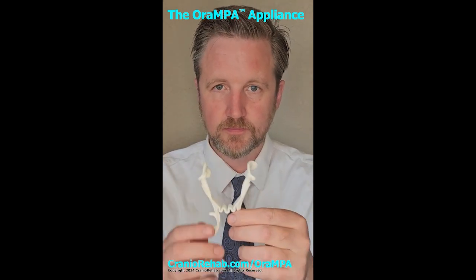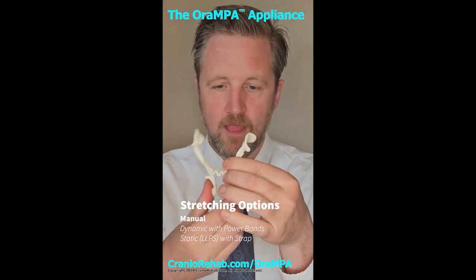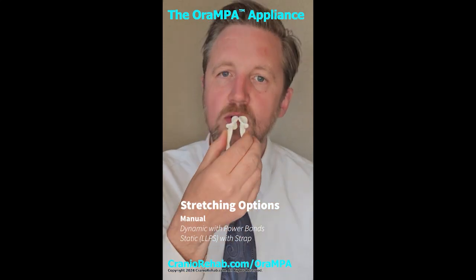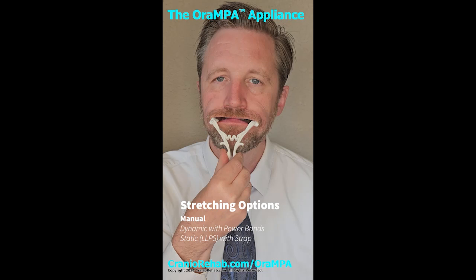With that, we also have 3 different ways of stretching. We have manual stretching, so Rob's going to go ahead and insert that in his mouth. And it sits in between the lip commissure areas. And you can manually stretch with your fingers. So the therapist can do that or the patient can do that.